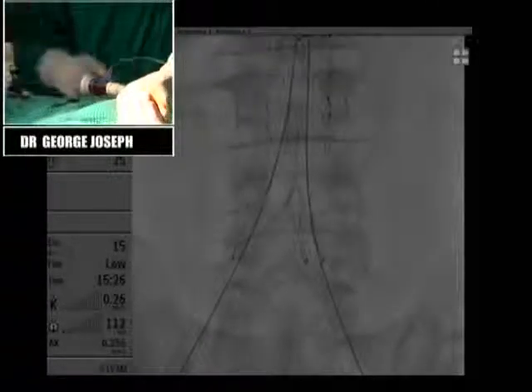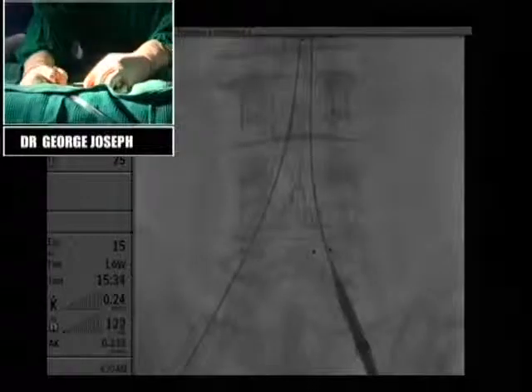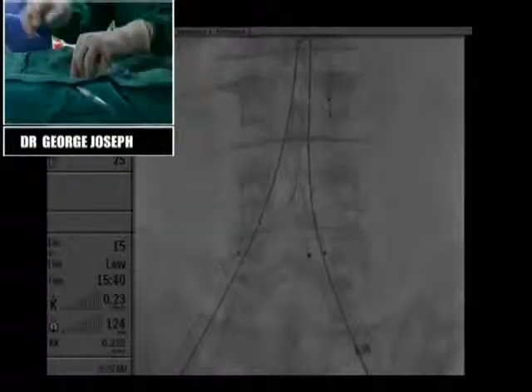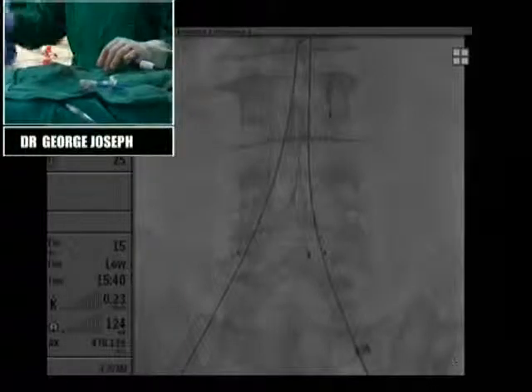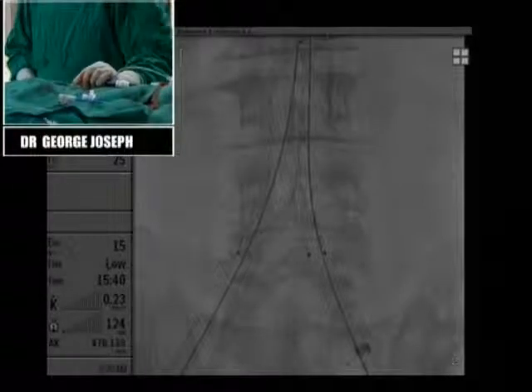While they're changing the sheath, any comments on how routinely you balloon the fixation? I do, depending upon whether the aorta is very atheromatous, in which case I'm a bit concerned. But usually you should. This is a self-fixating device, there are hooks at the top. You can balloon it. It looks like a reasonable neck, I don't think there would be a leak. But if it's a short neck, then obviously you need to balloon definitely.